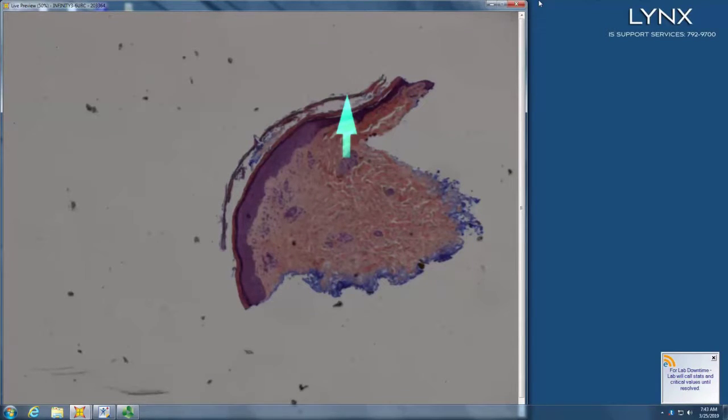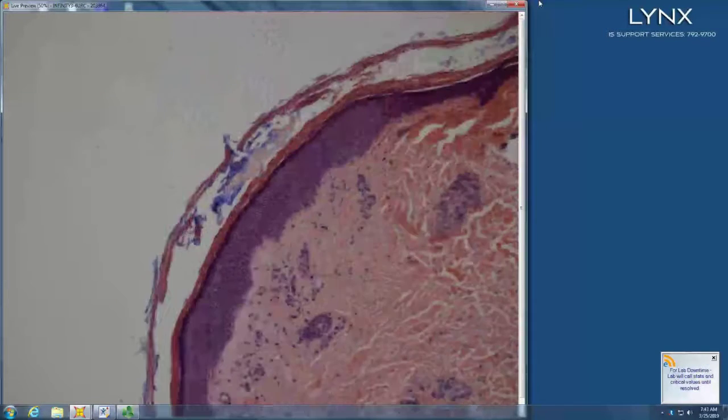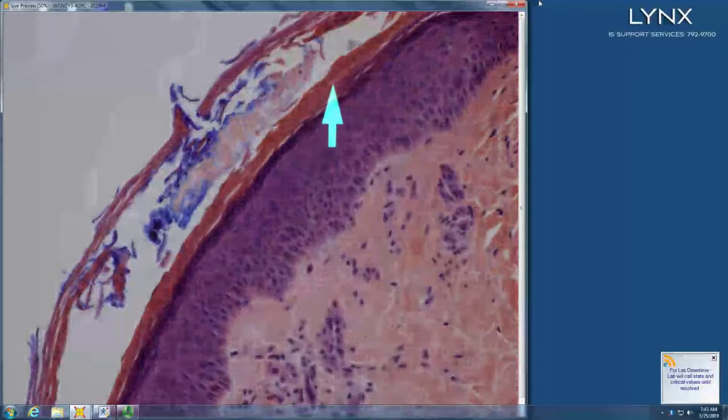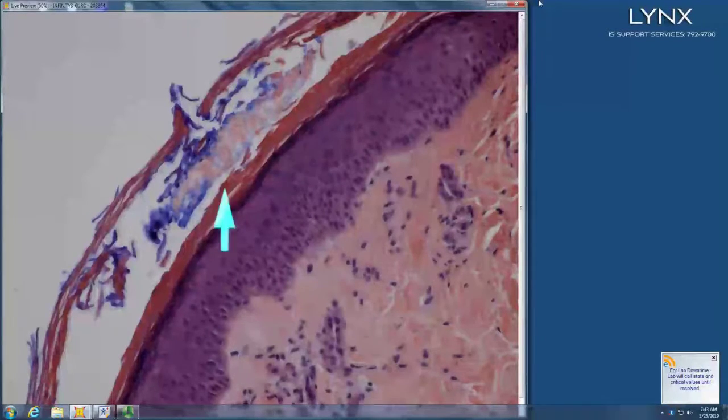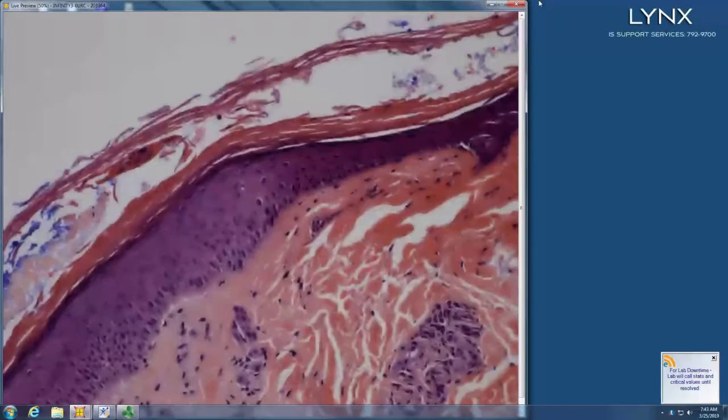Normal corneum sitting on top of a layer of compact corneum. So I'd always want to look in the compact corneum to see if there's something there, because that layered horn is a good clue for tinea.